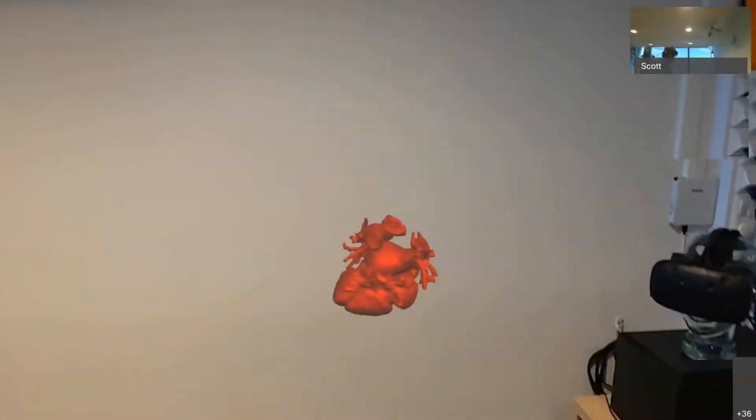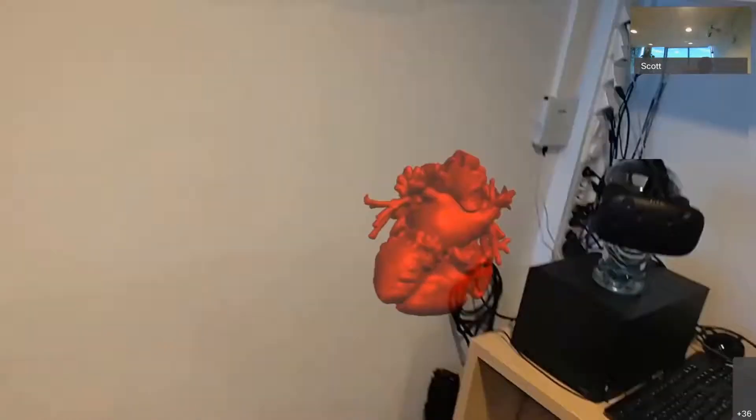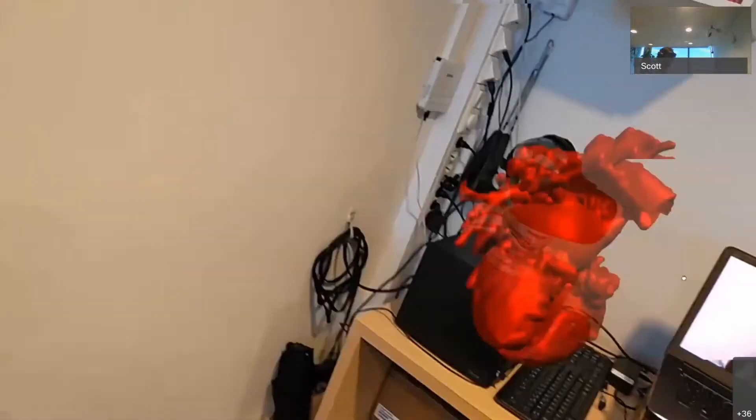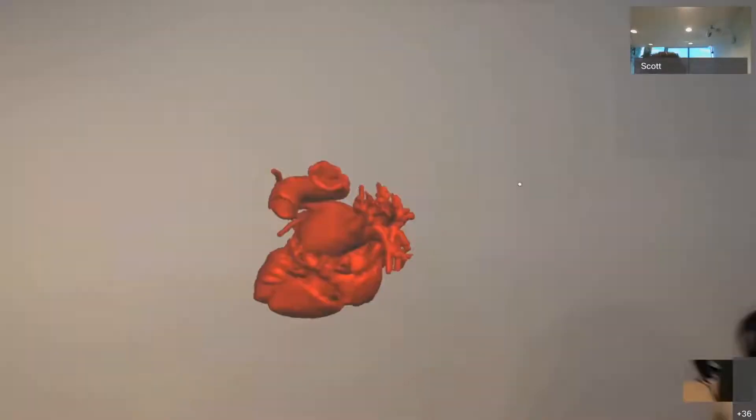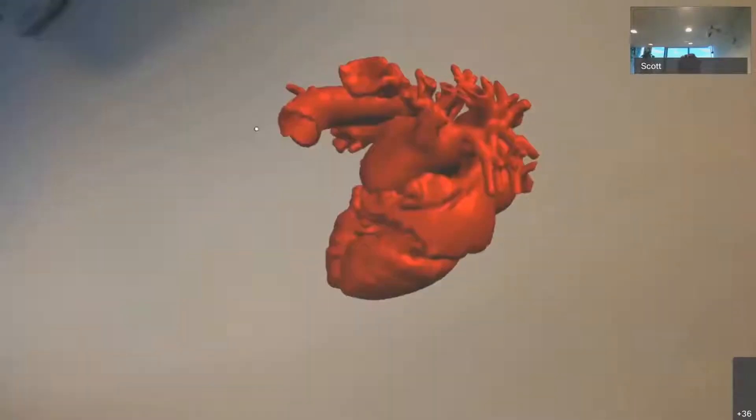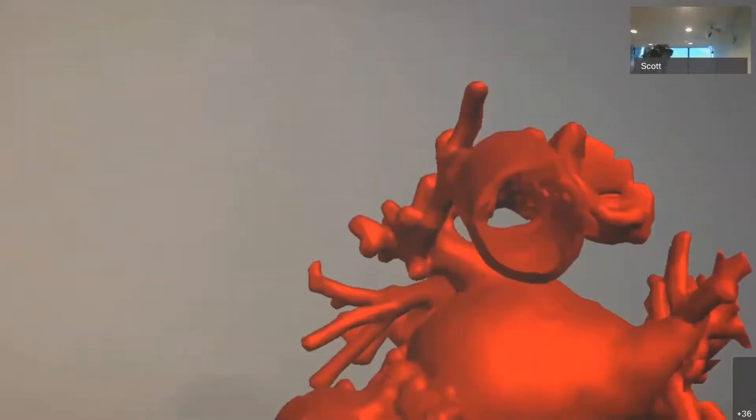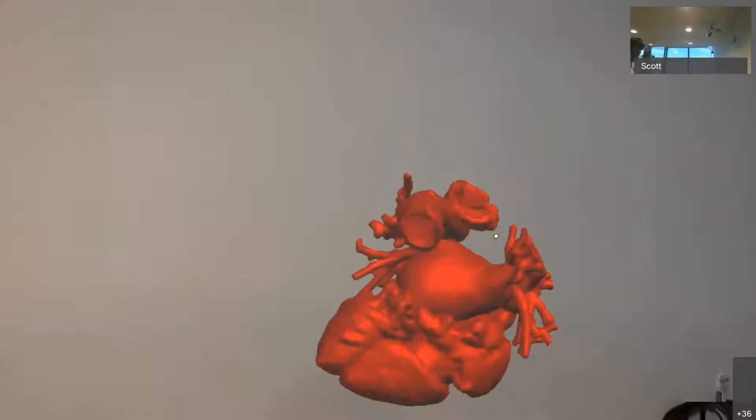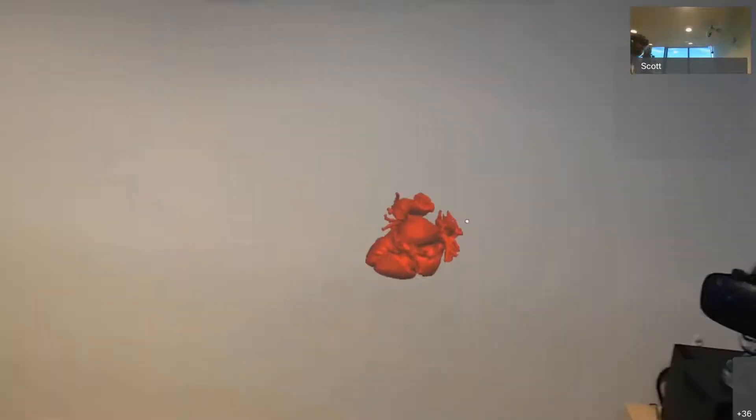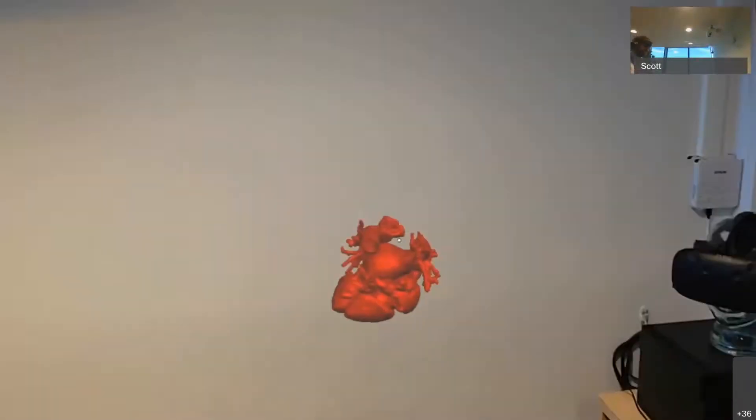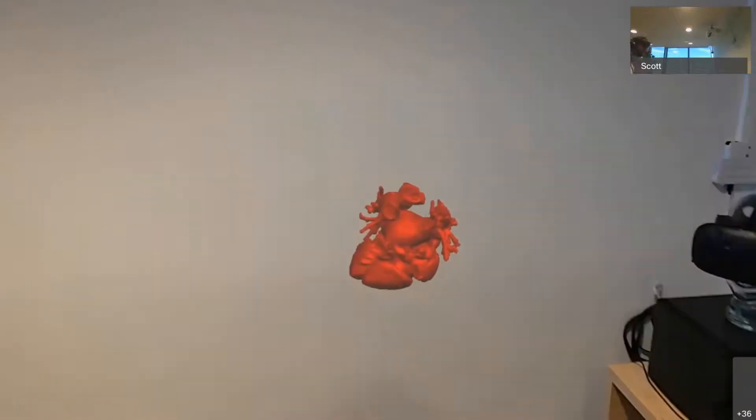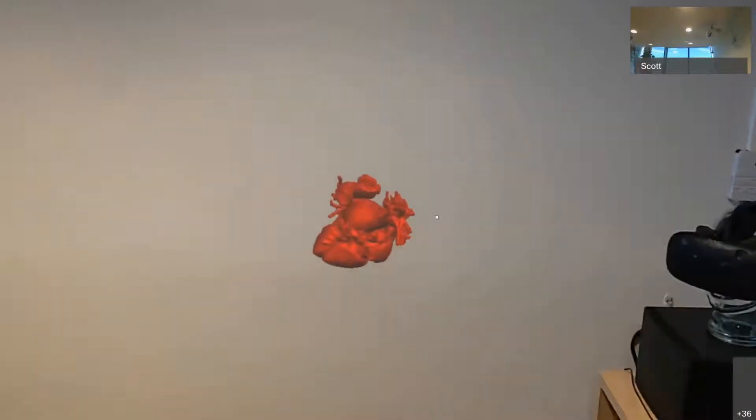So I can move around the heart. You'll see that it stays anchored in place. I can get closer or further away. And so this front end is made using the Unity games engine, and the back end storage and services are hosted in Azure.